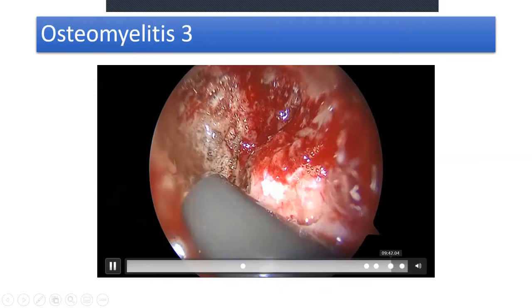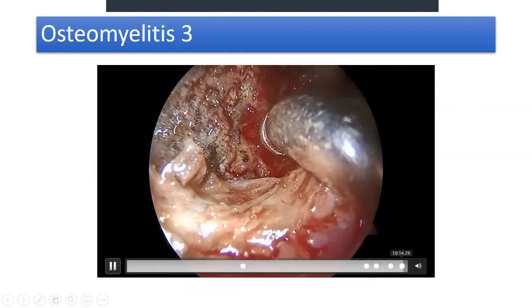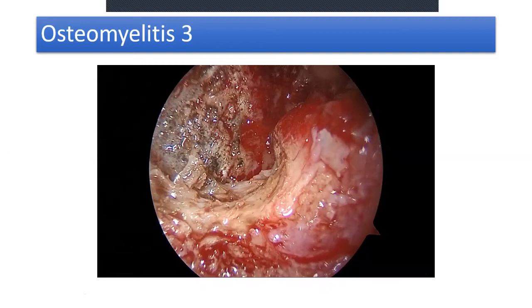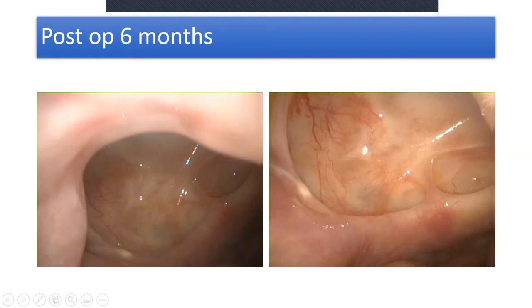One month post-op: some gel foam with antibiotic solution is placed inside. At six months post-op, exactly the same area — it beautifully epithelializes and the patient is absolutely symptom free.